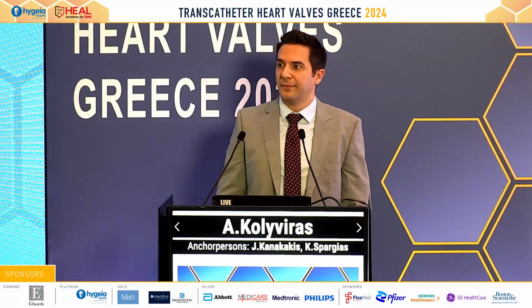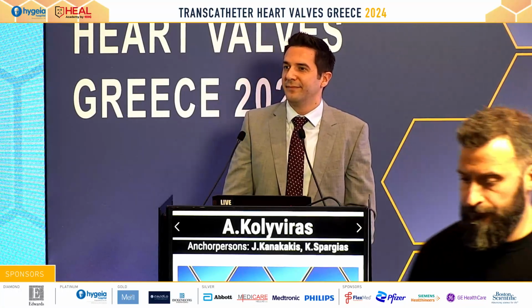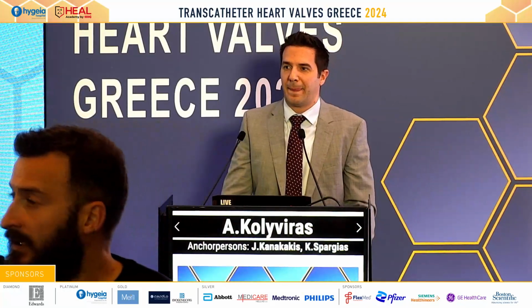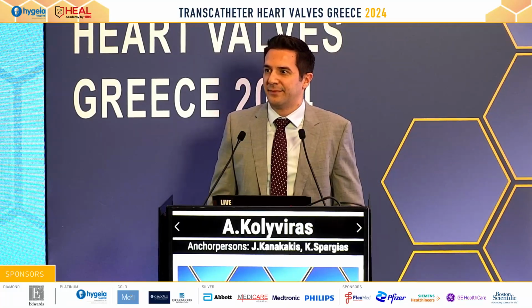Yes. Dr. Triantafyllou. Just a short comment. Congratulations for the presentation. It was complete. For the algorithm with the MANTA, if you arrive at the final salvage by MANTA, you must not forget to store the image of the puncture, because you will be based on that. So, okay, you do the echo-guided puncture, but you must store the image of the needle at the point of puncture, because then you must advance 2 centimeters.